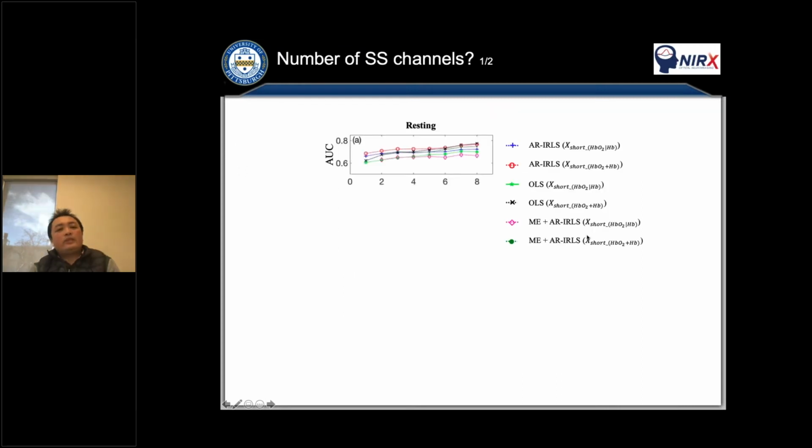So the next question: we know from the previous slide the short separation channel will improve the performance. The question is whether we need to use only one short separation, or we need to put short channels in every source position, because some groups also proposed that idea, that we need short separation in every source.